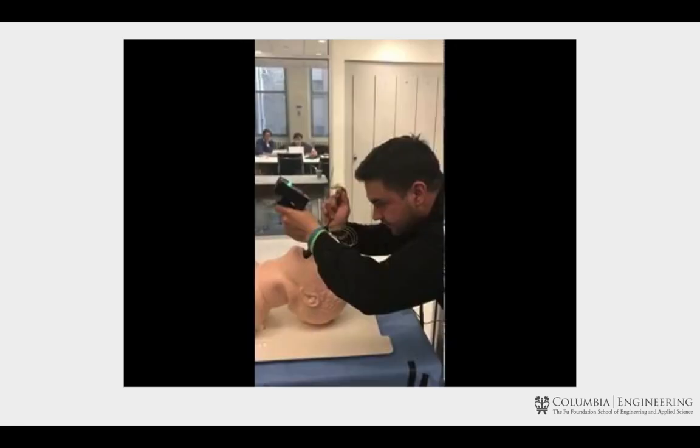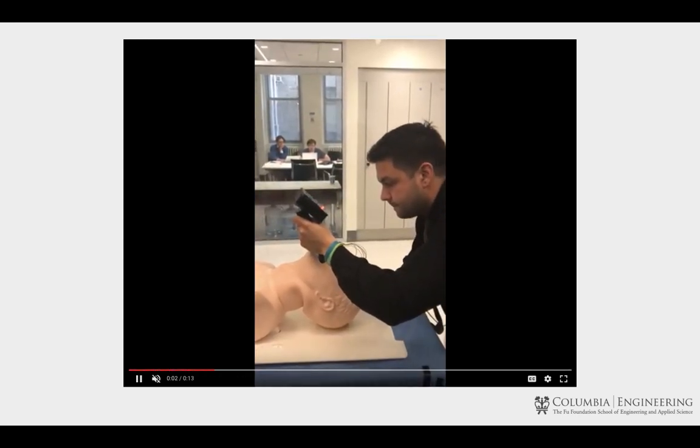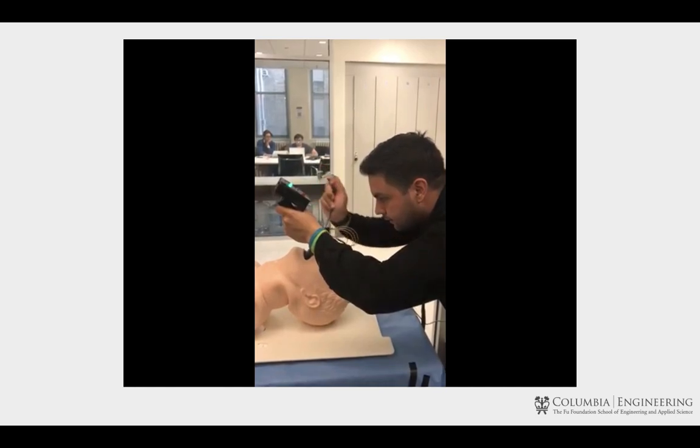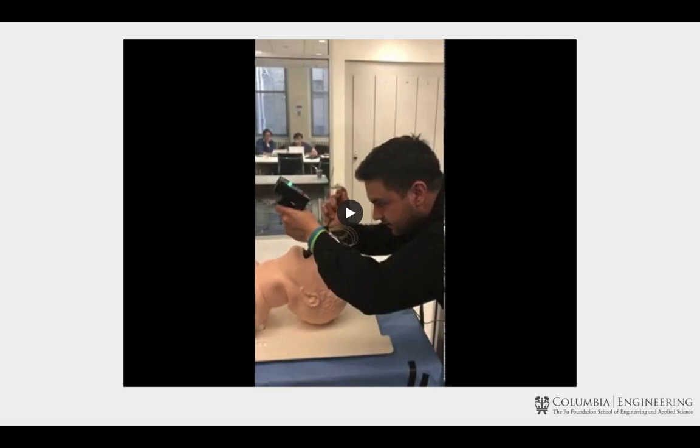Here we have a novice intubist. He first puts the blade incorrectly into the esophagus — he's notified by a red light and appropriately adjusts so that the green LED lights up, indicating that it's now okay to insert the endotracheal tube. Without the feedback that our device provides, he would have mistakenly intubated the esophagus, resulting in ventilation of the stomach as opposed to the lungs — a very dangerous situation.